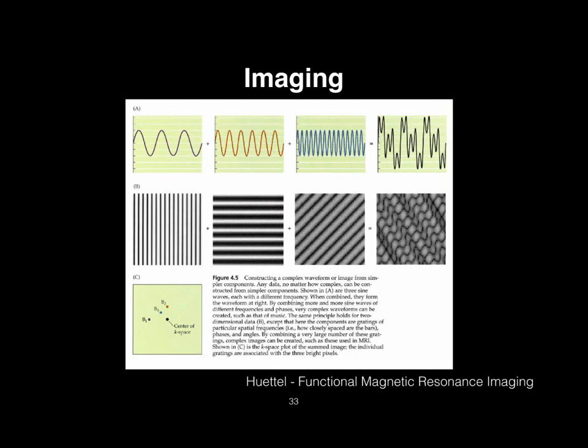Okay. If we walk along the x direction here, it means that we're encoding at this location something that has this variation. We have a sinusoidal variation along this way, right? If we go straight up in the y direction, we have something that varies along y sinusoidally. So again, it's sinusoidal, but now the variation is this way. That's what this here represents when you are back in image space.